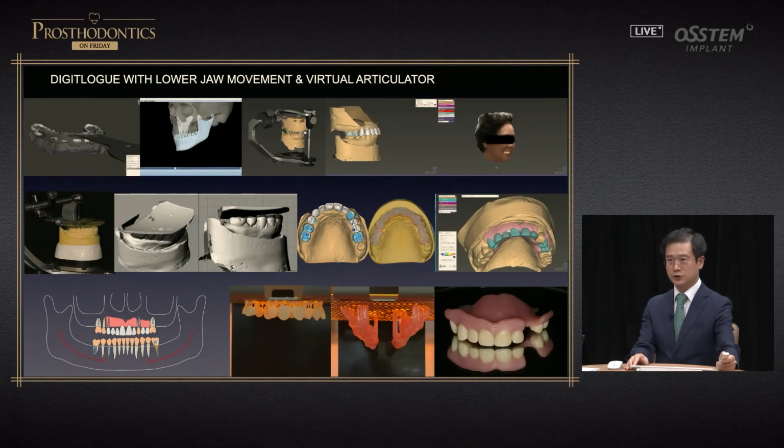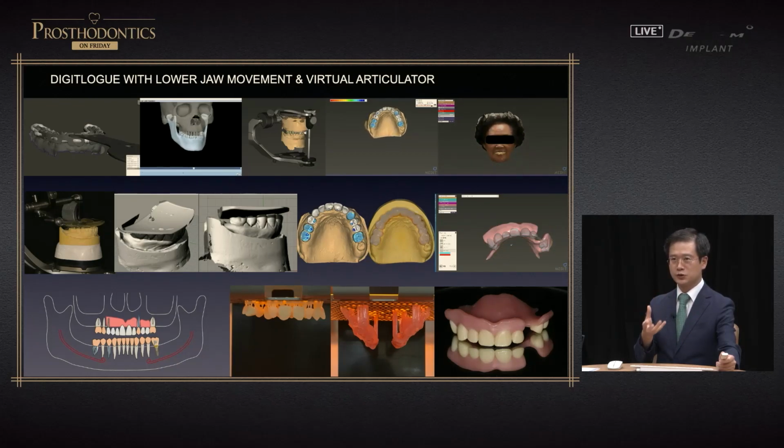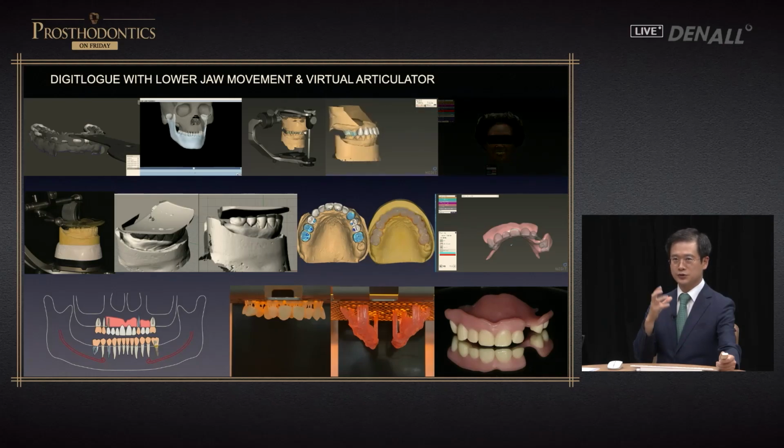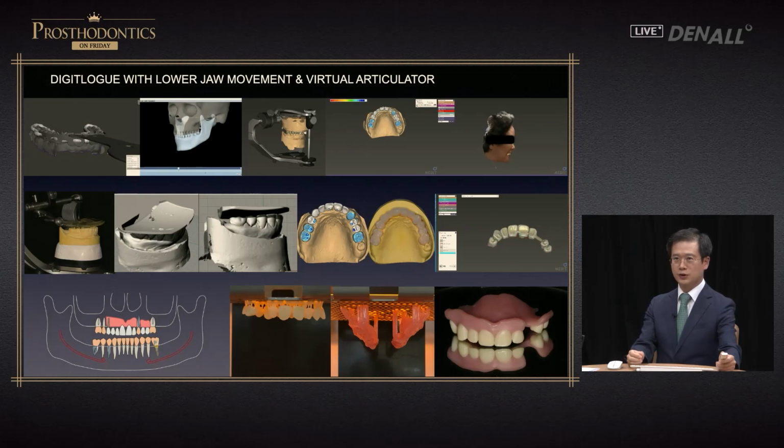At the clinic, the lower movement is recorded on the virtual articulator. Movements of the patient, facial scan, and customized movement records are utilized.